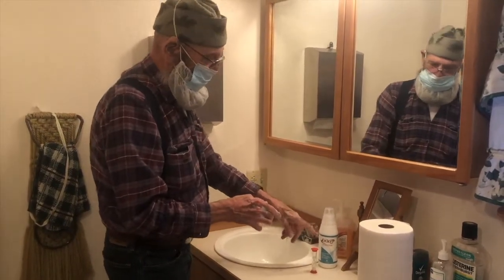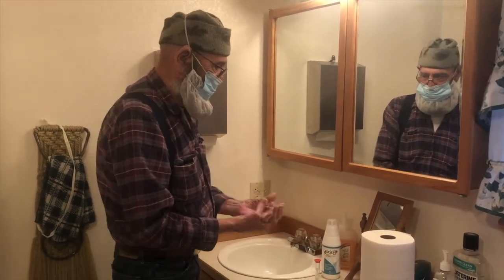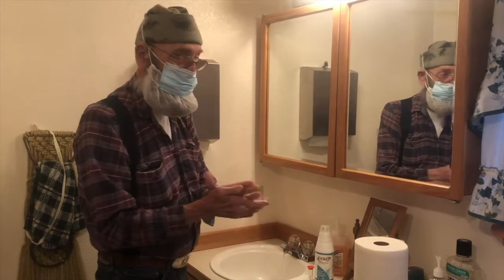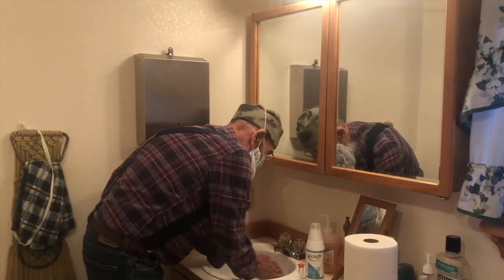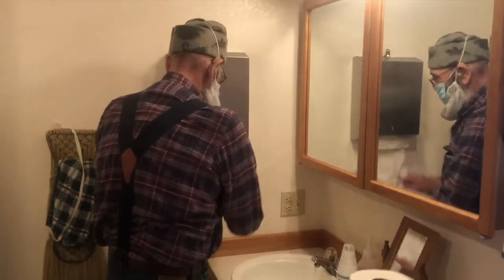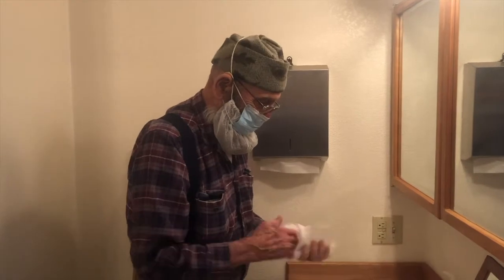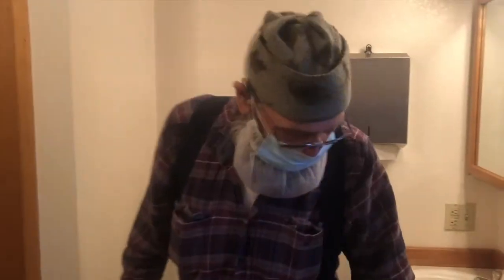This is my site cleaning fluid. I do that every day. I clean my site with this site fluid. And then I have a salve in there that I put on that site every day too. So anyway, we got our 2 minutes in there. Then you use these throwaway towels. Turn the water off with that, so you don't touch any of that. And then back in here.